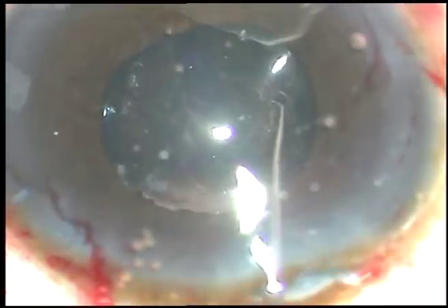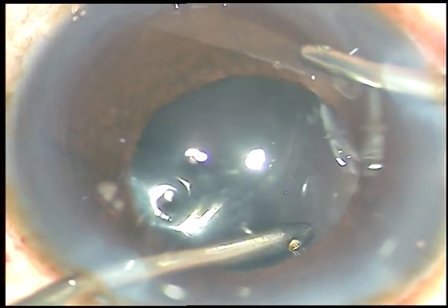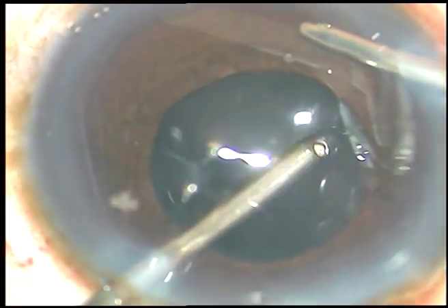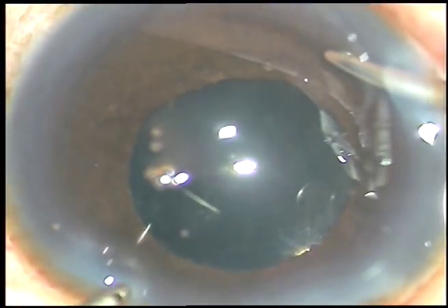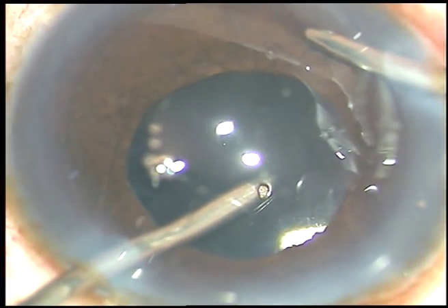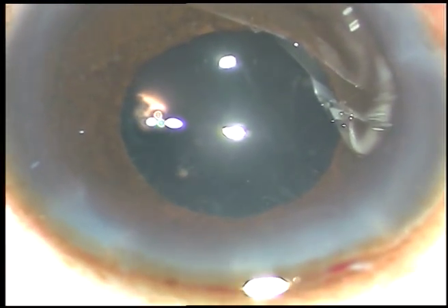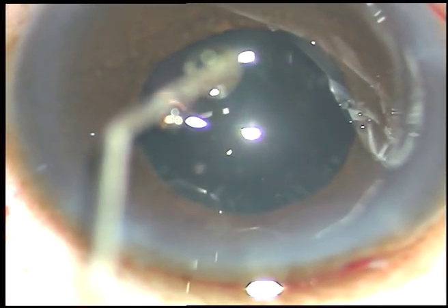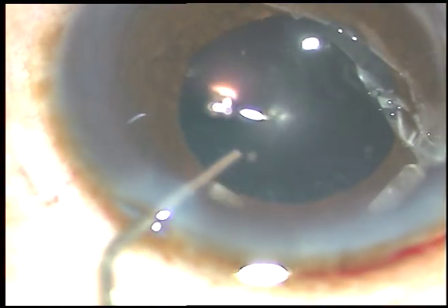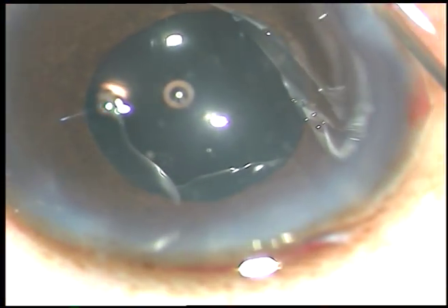Now thorough cleaning of the viscoelastic substance is very essential. The viscoelastic substance in the anterior chamber has to be cleaned very thoroughly. The case is done. We just have to hydrate the side ports. Let's do a final lavage of the anterior chamber and conclude the case.